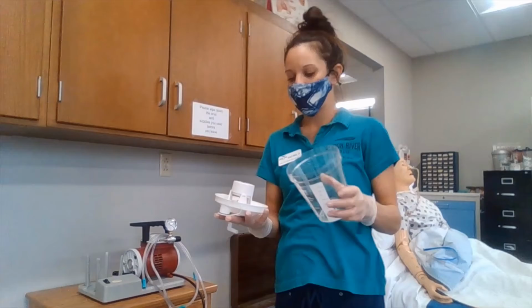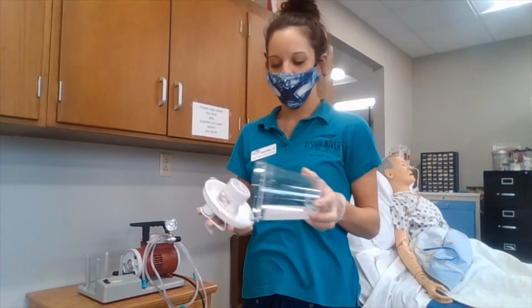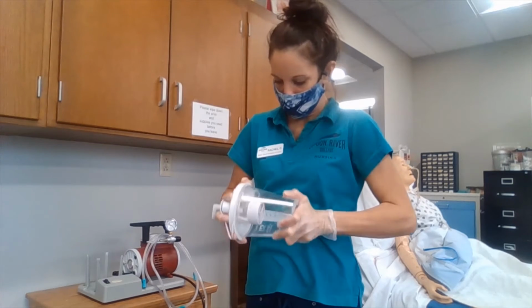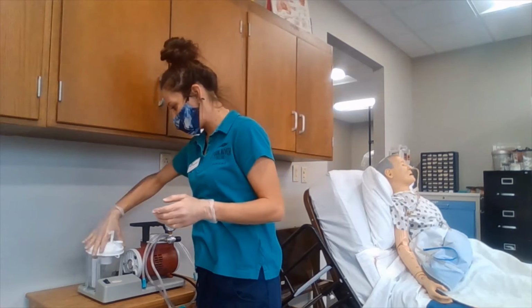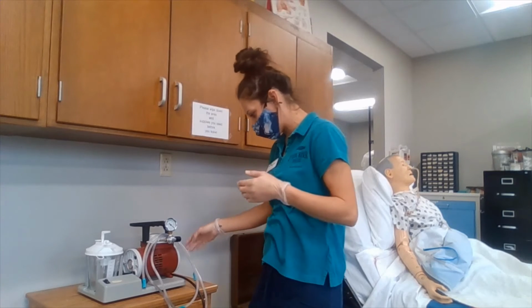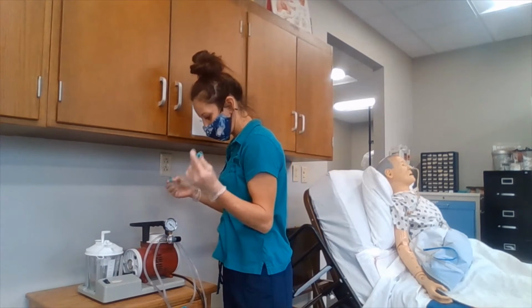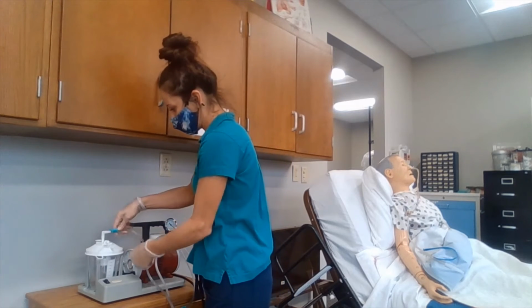For our initial equipment setup, we are going to locate a canister. We're going to make sure that we are placing it in our suction device here. We're going to make sure that our suction device is plugged in. We are going then to attach our tubes here. So the shorter one's going to go like this.